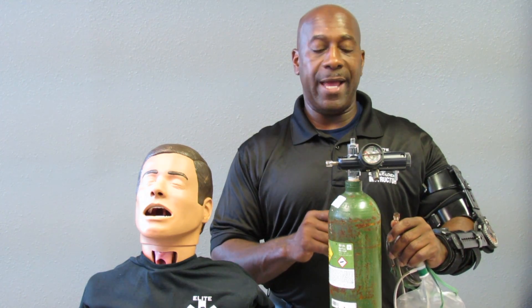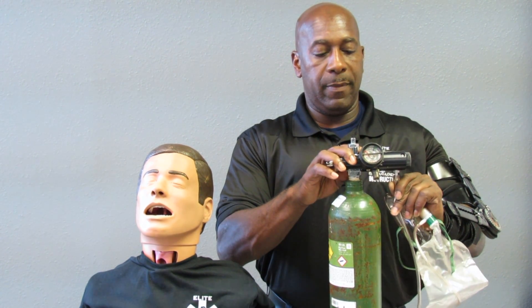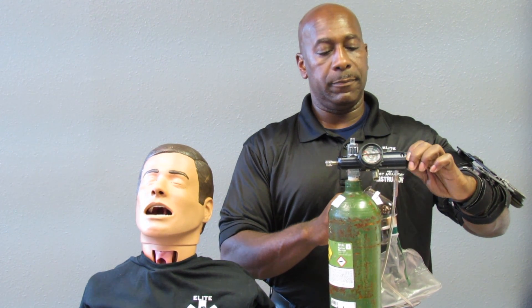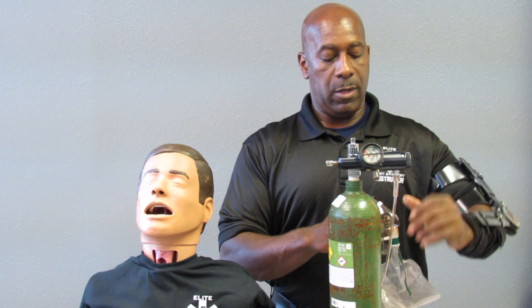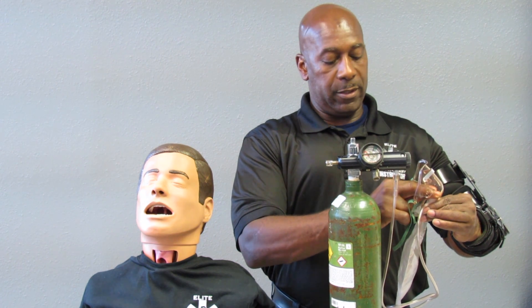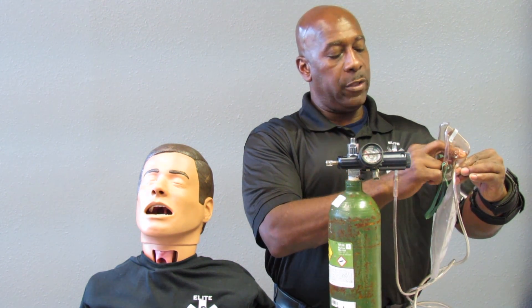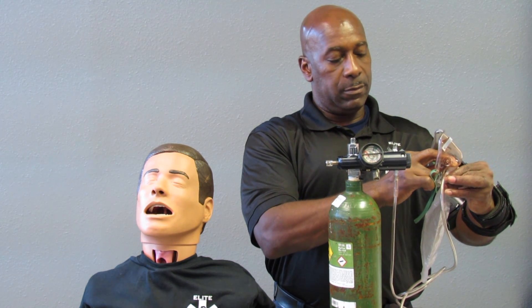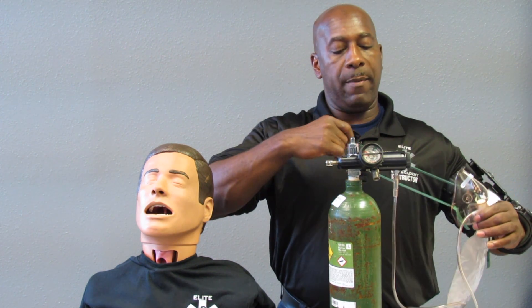Attach your oxygen tubing to your regulator and pre-fill your reservoir bag, adjusting the oxygen flow to at least 10 liters per minute. Pre-fill the oxygen bag by holding your two fingers and depressing the plastic area over the holes until the reservoir bag is pre-filled.